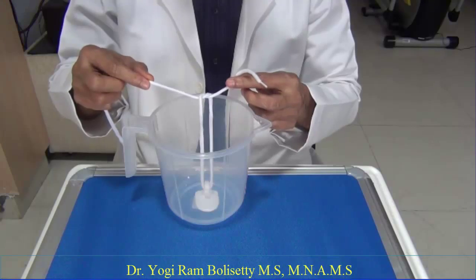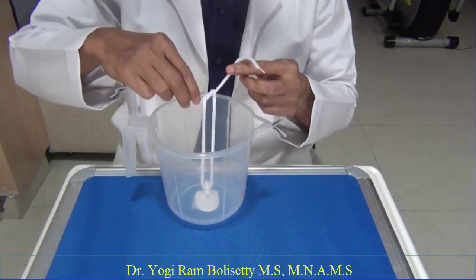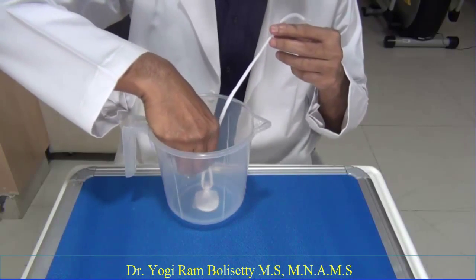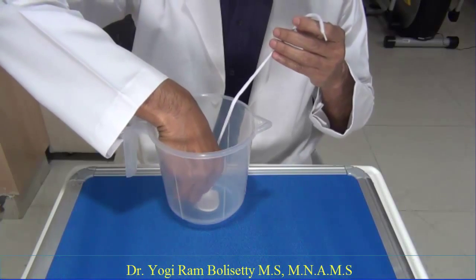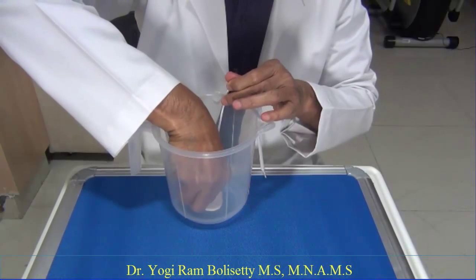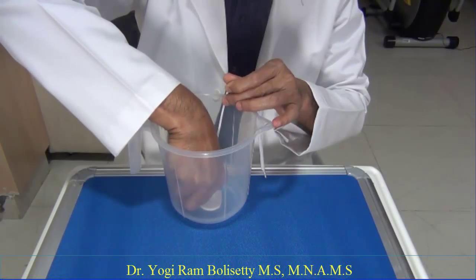You are going to form the first throw outside the cavity. Then you have to slide it down. Get your right hand fingers nearer to the throw, and pull the long strand in the downward direction and the short strand in the upward direction. You must make a 180-degree pull. The short strand is pulled upwards and the long strand is pulled downwards by the right hand.